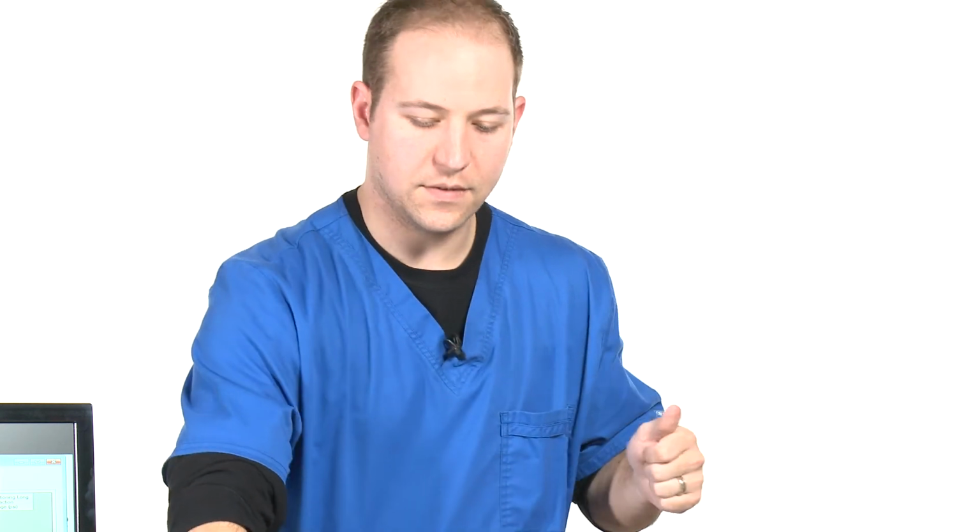The patient will ask if there are any negative side effects. Some patients, especially elderly patients, postmenopausal patients that actually utilize the InTone device, initially in their first maybe week to 2 weeks, may experience some bleeding. The patient should not be concerned with this. It may happen, and after a couple weeks it will go away. It does not hurt the patient. It may just be a little inconvenient.